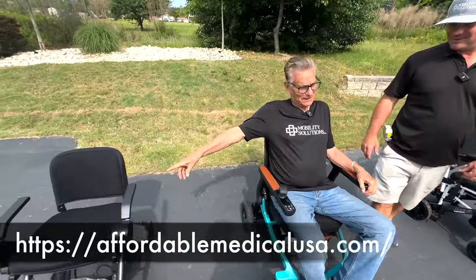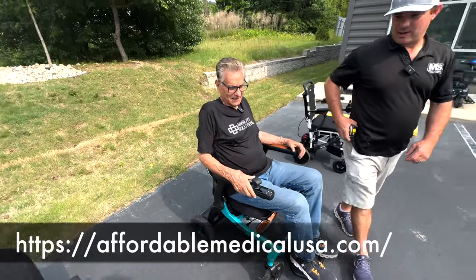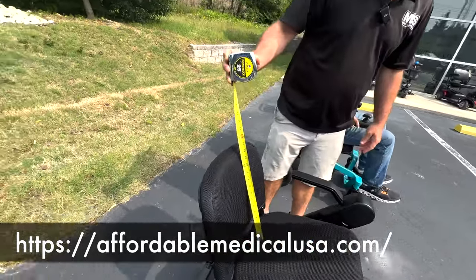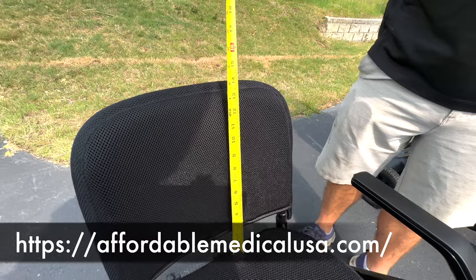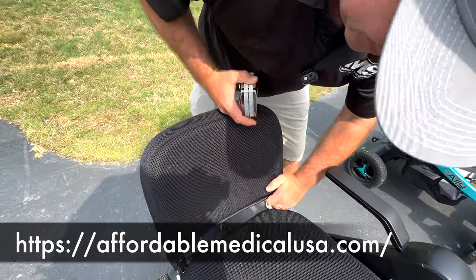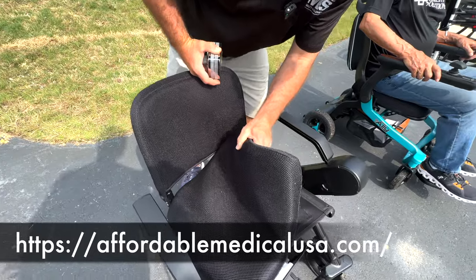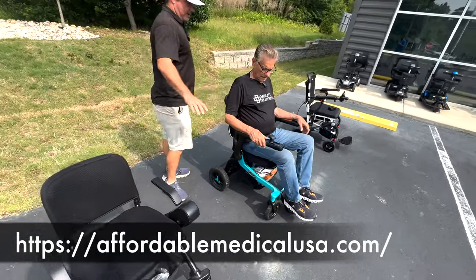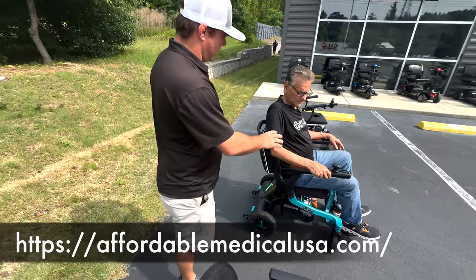Oh, no, this is an 8. No, that one's a 7. A 7? Yeah. This one has a higher back. Check out the back. Yeah, higher back. So the back is about 14 inches from the seat. And I don't think you can adjust that. You can't. This does have a removable seat cushion, as do that one and that one. All right, so you gave this a 7? Yeah. And then this one an 8?